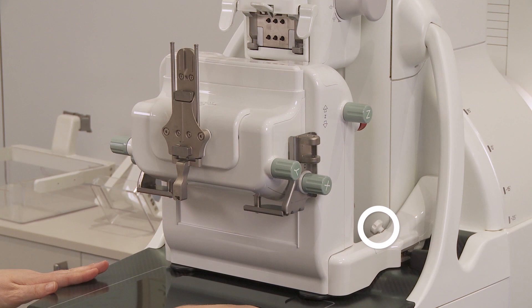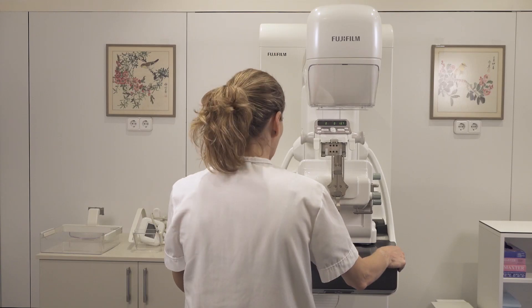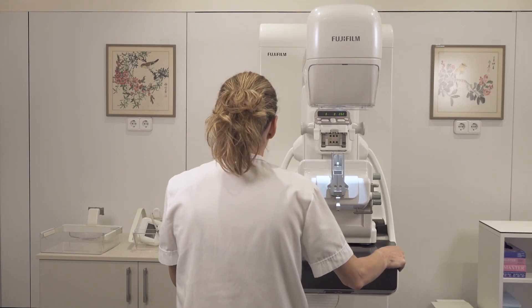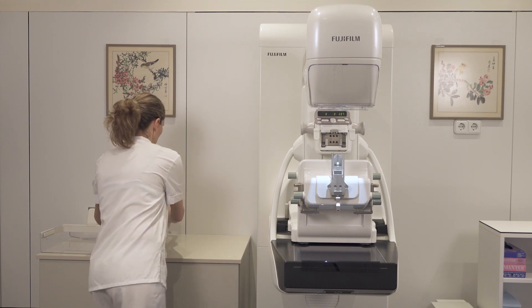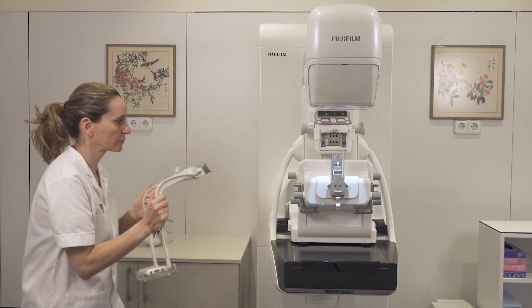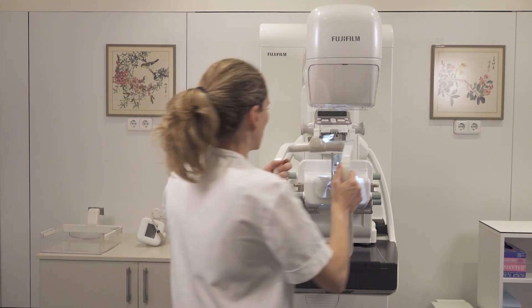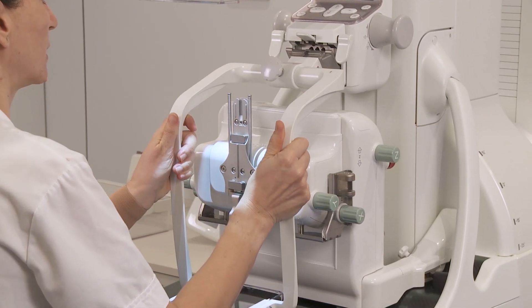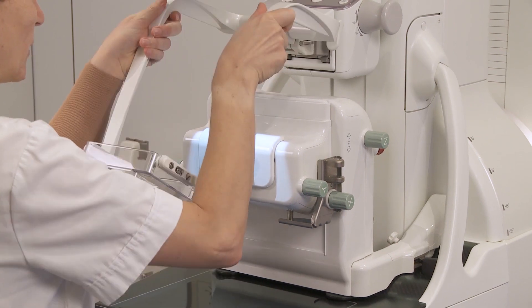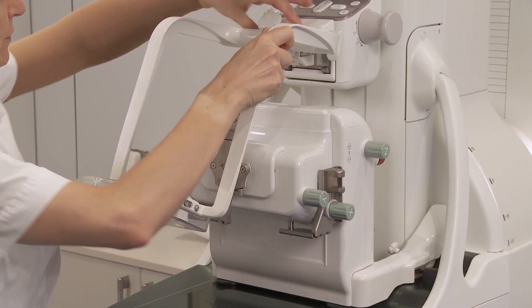Ensure the compressor paddle assembly is in the highest position. Attach and lock the biopsy paddle as shown.